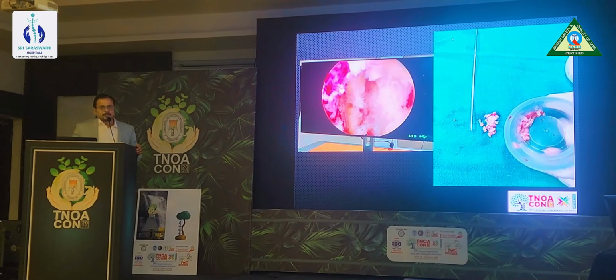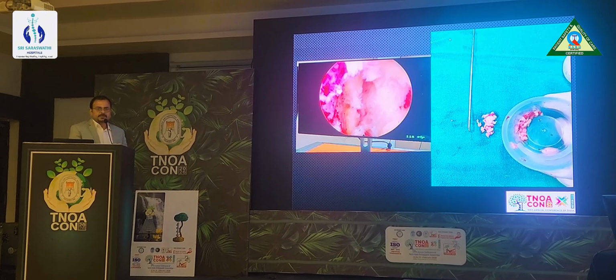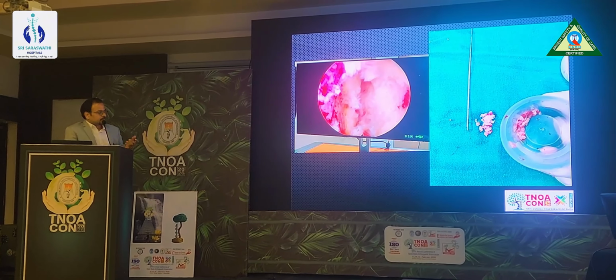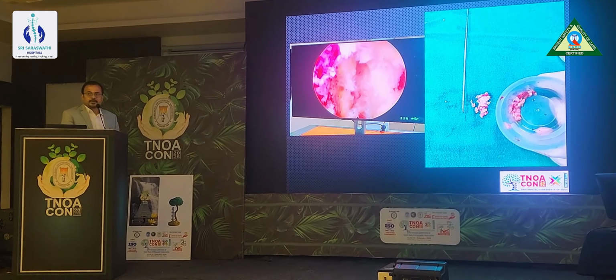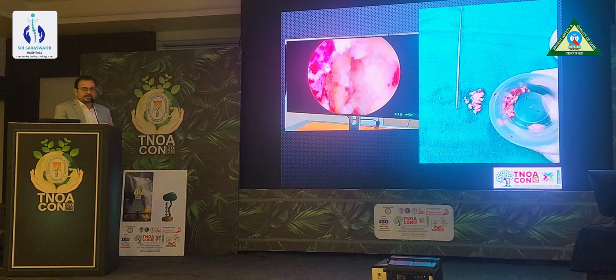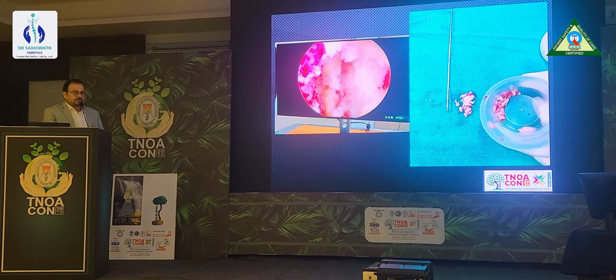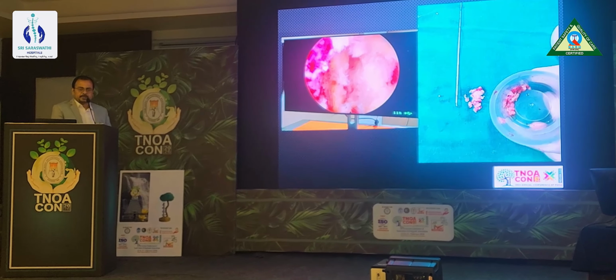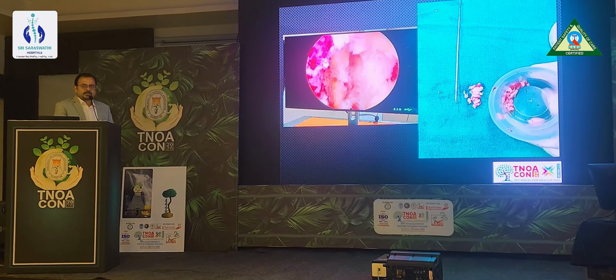So in conclusion, transforaminal endoscopic spine surgery is not a procedure per se, but it is a pain-relieving philosophy. When you plan properly, select the patient, and then land on the precise target, we can achieve good pain relief in awake and aware patients through a natural corridor.